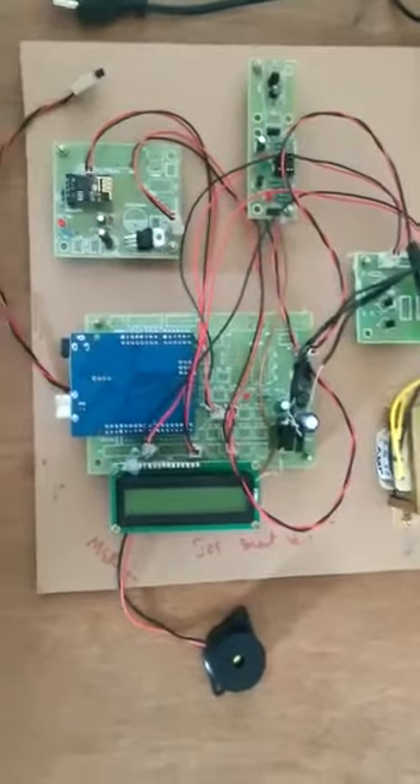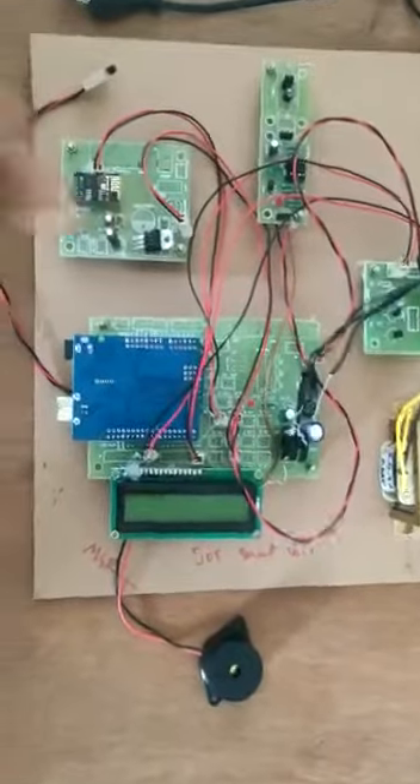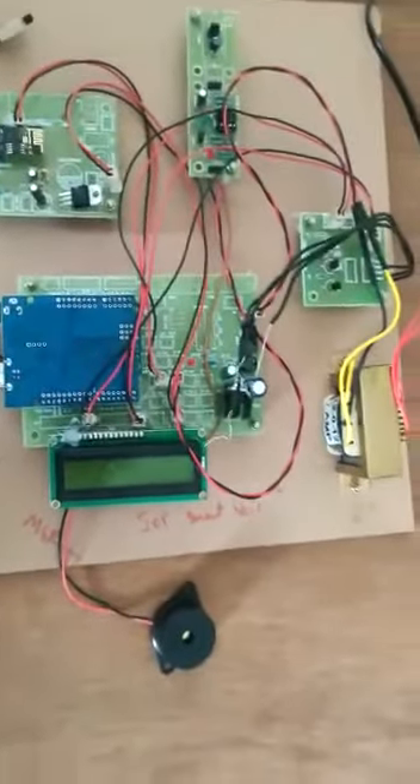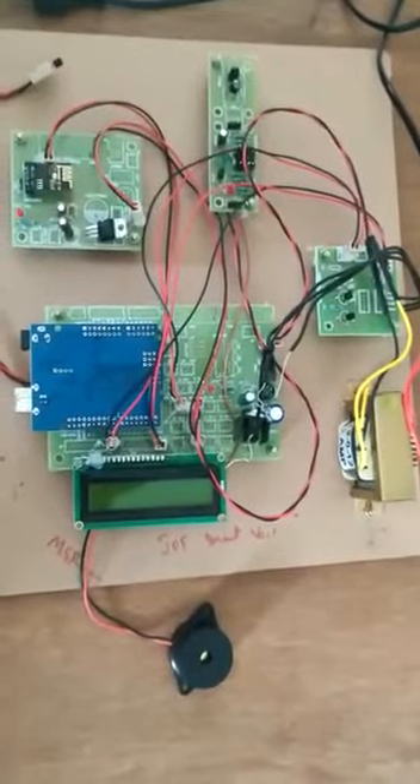Our project title is Smart Saline Bottle. Let's get started. Here we can see the components. Arduino, heartbeat sensor, and level sensor — those are the inputs of Arduino.